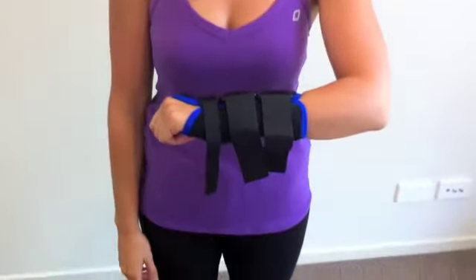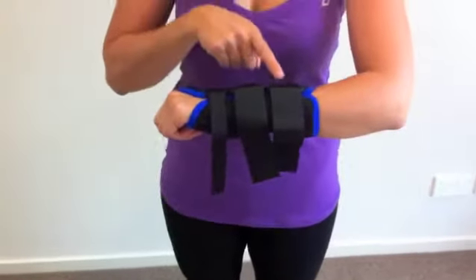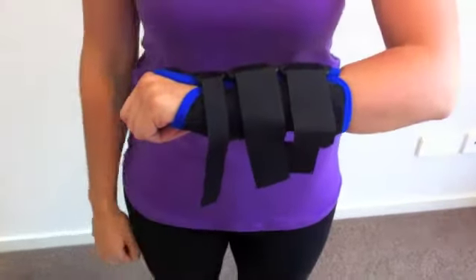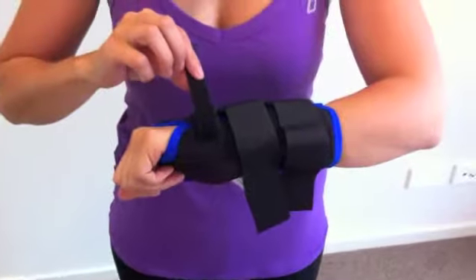This is Gabby and today she's modeling the DeRoyal wrist splint. As you can see, the DeRoyal wrist splint has three Velcro straps running across the wrist brace. They provide adjustability for the tension. They look a little bit long today, but they can be trimmed to the length that you require them.